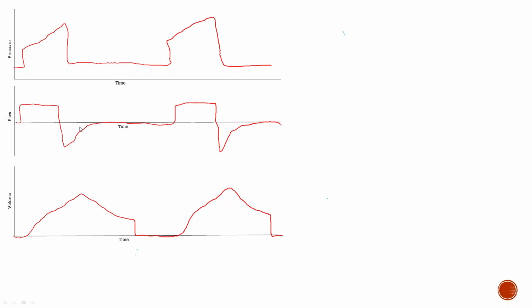So the main point for this curve is that the flow is actually reaching the zero line, so there's no auto peep here. You might have been looking at this. Leak is correct. Harris had said it first, so let's not give you credit. But there's a leak, obviously, right here. And this is a really quick way to see it. The leak is somewhere else.